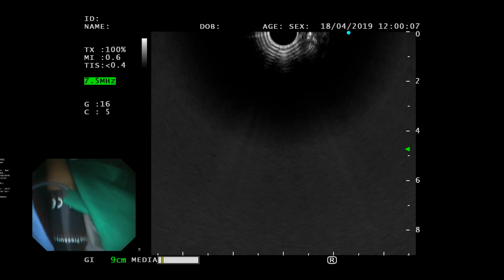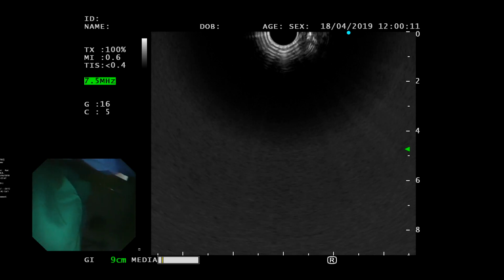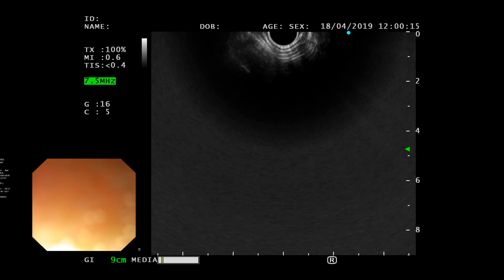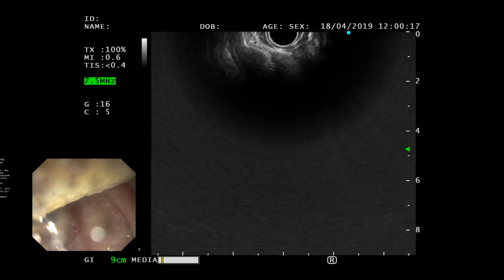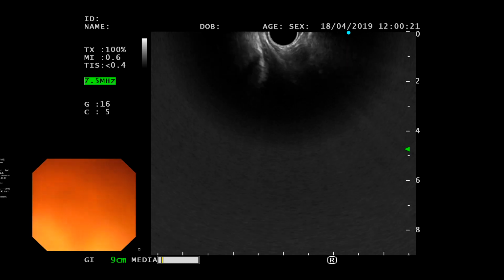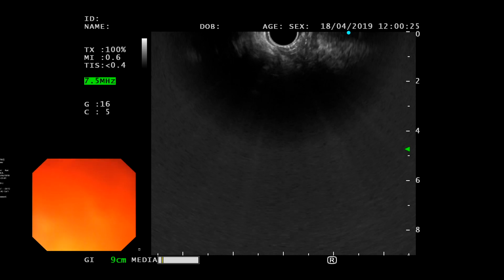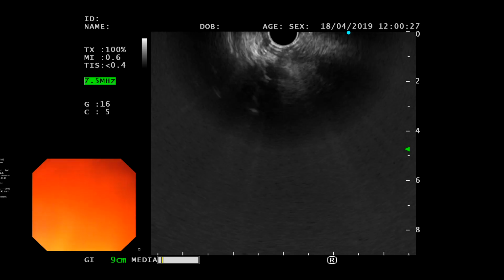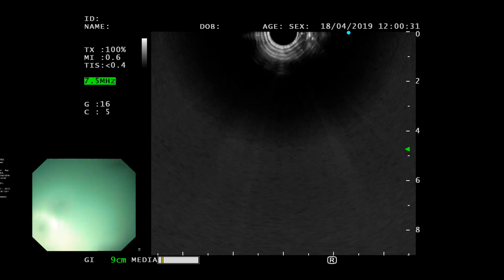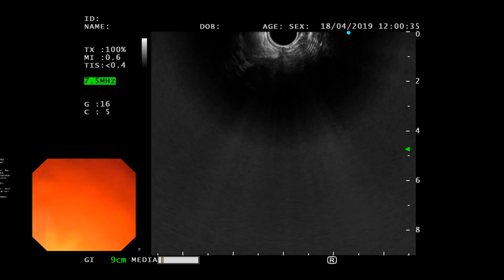Okay? But go in with a little bit of thumb towards you, but hold it from here. You should have a nice firm grip on the scope. There you go. Now just advance it, thumb towards you to get over the tongue. But don't spin inside. You can't do that. You have to stay on. Yeah, that's good. Like that.